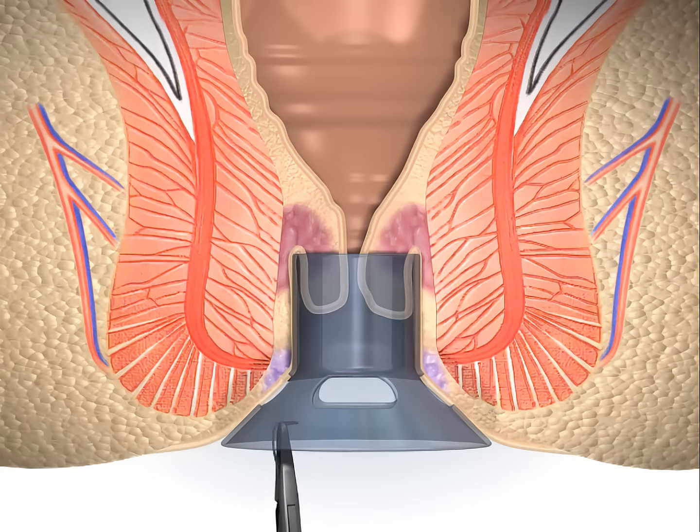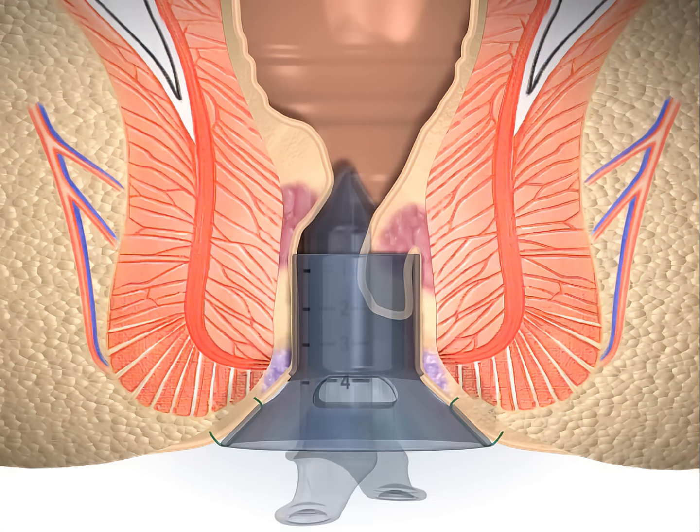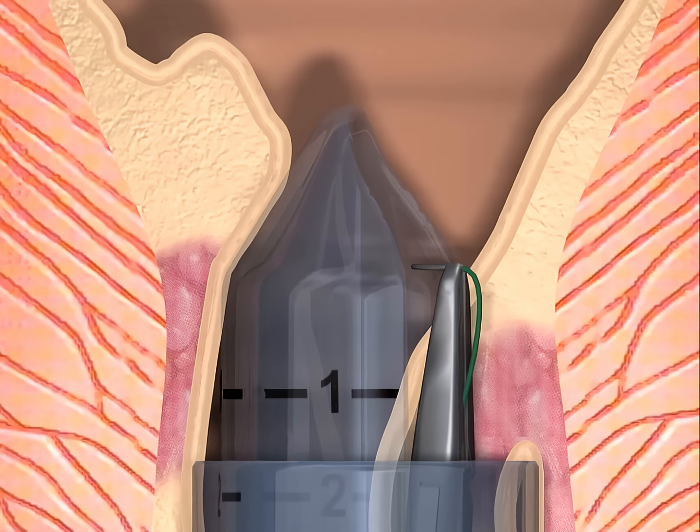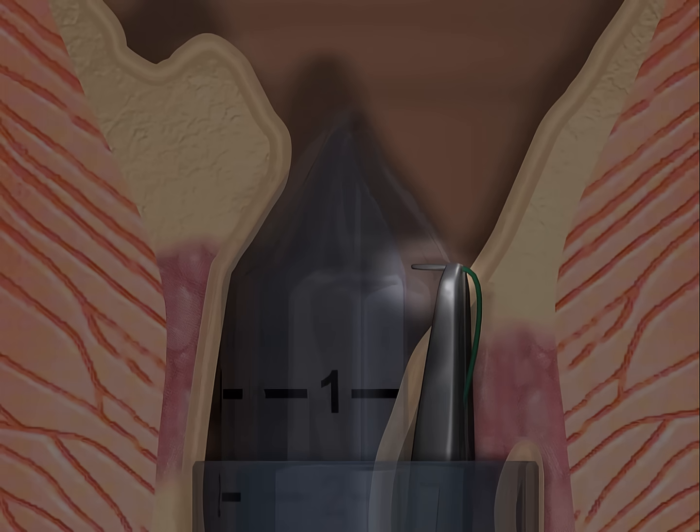The circular anal dilator is fully inserted and affixed to the perineum with 3 to 4 sutures. The purse-string suture anoscope is inserted through the circular anal dilator, facilitating a circumferential purse-string suture of only the mucosa and submucosa. The purse-string is positioned near the tip of the anoscope.